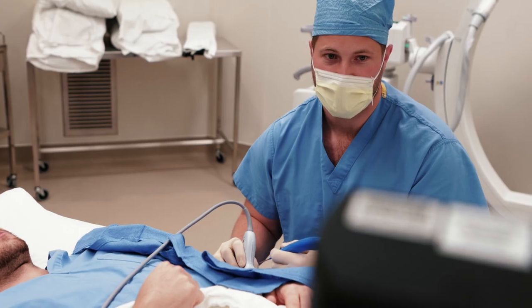This procedure changes the structure of the tendon and removes the diseased tissue that's causing the pain and dysfunction, thereby making therapy more effective for patients to get better pain relief and their function back.